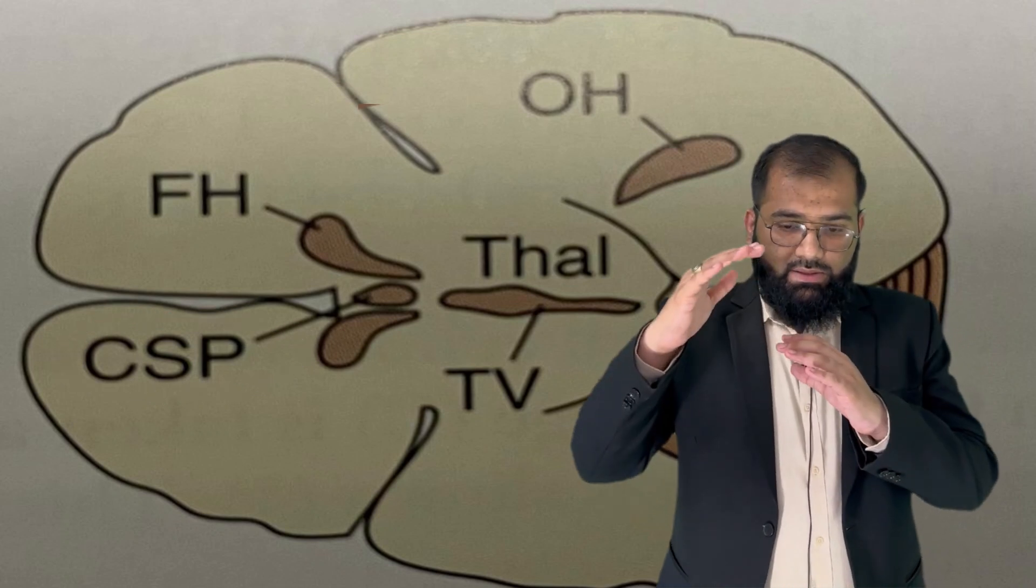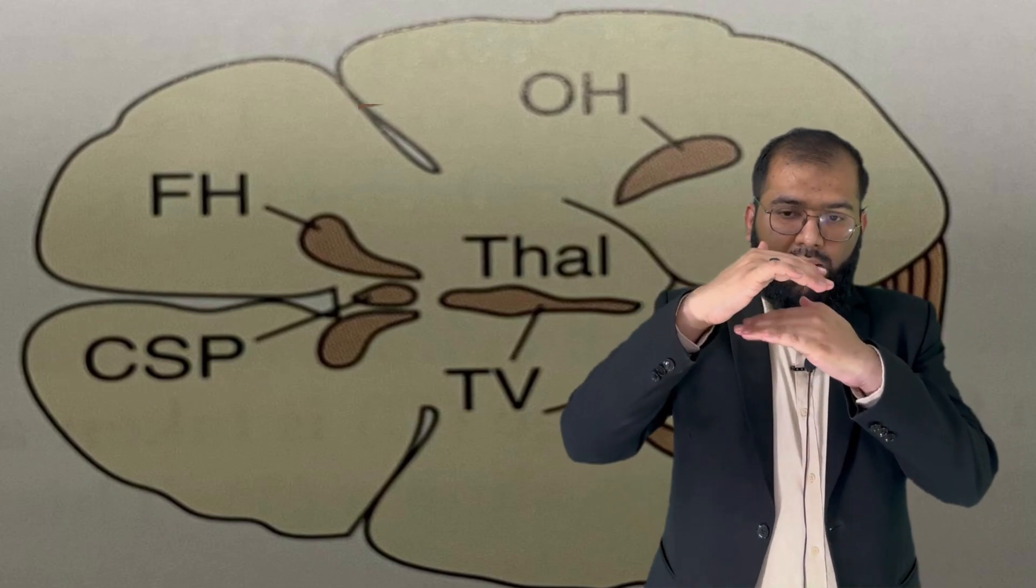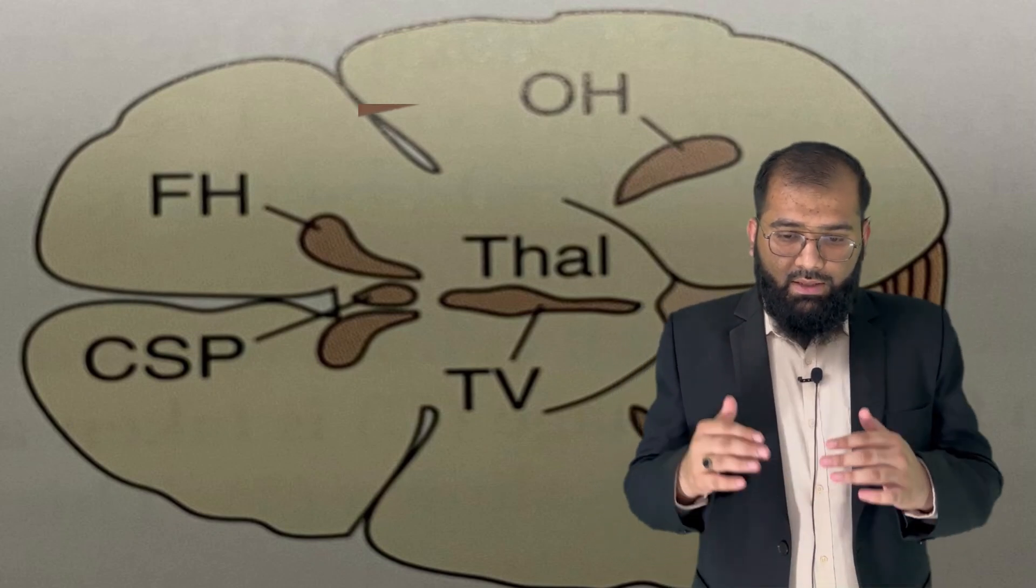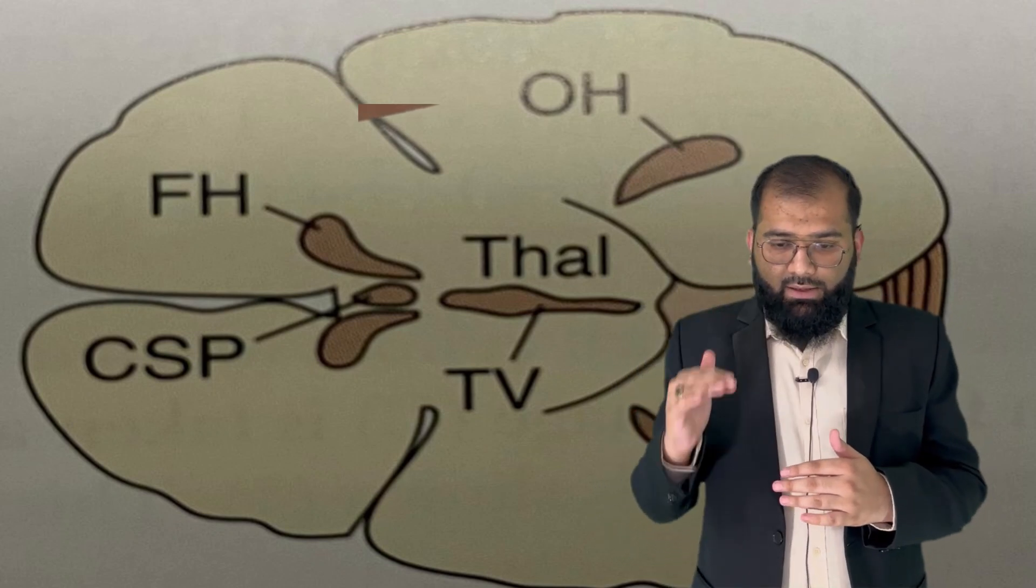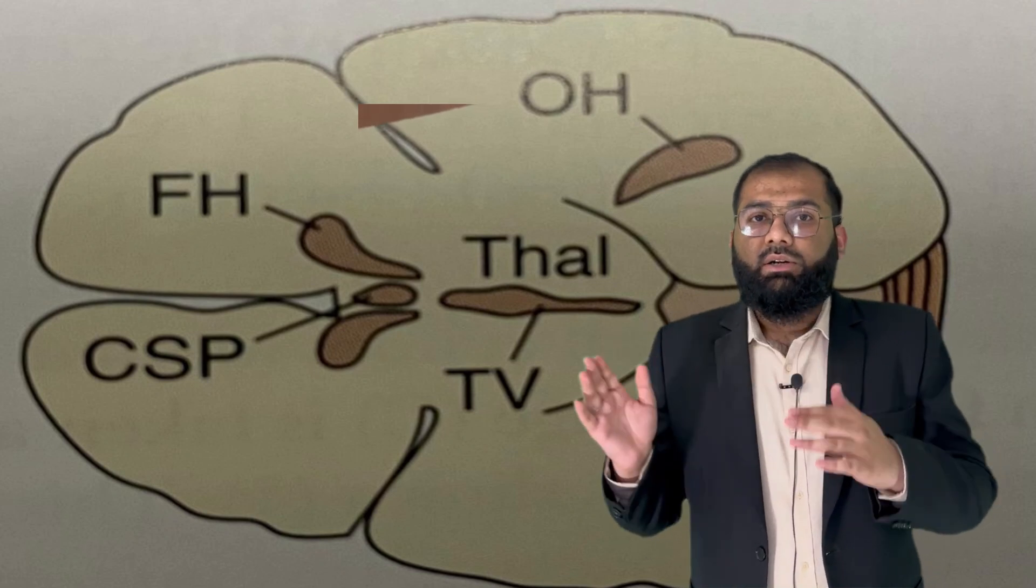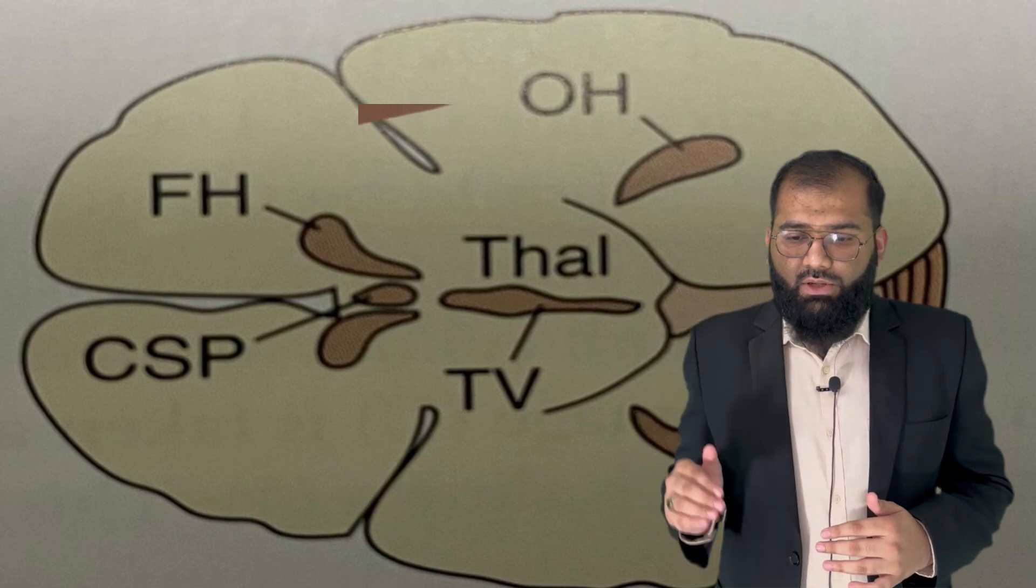CSP is a primitive space that is later taken up by the corpus callosum. Then you see there are two thalami; between the thalami is the third ventricle, and you are able to see the occipital horns.